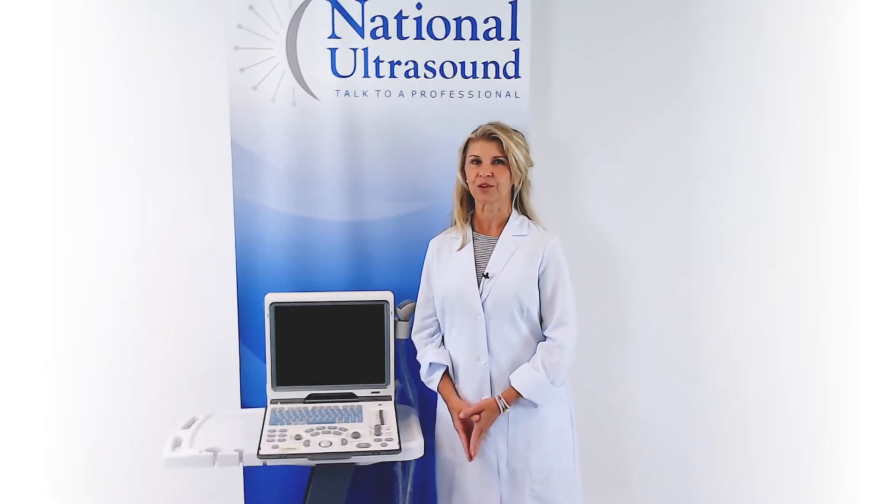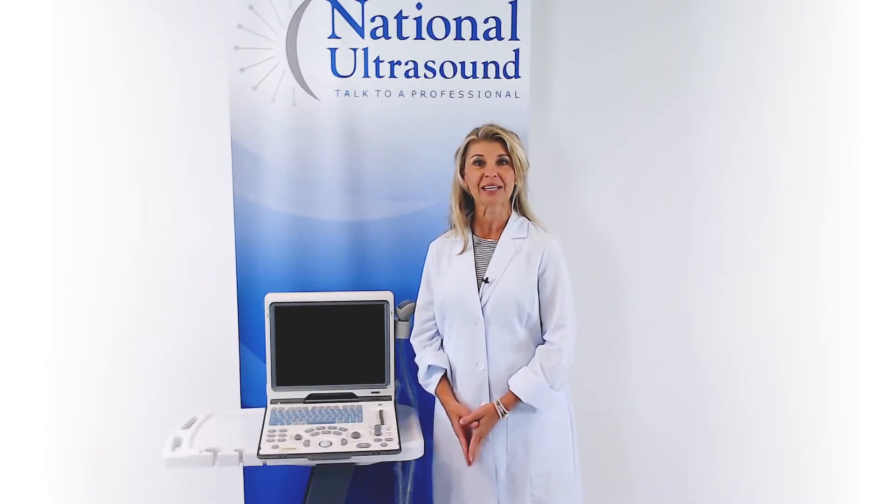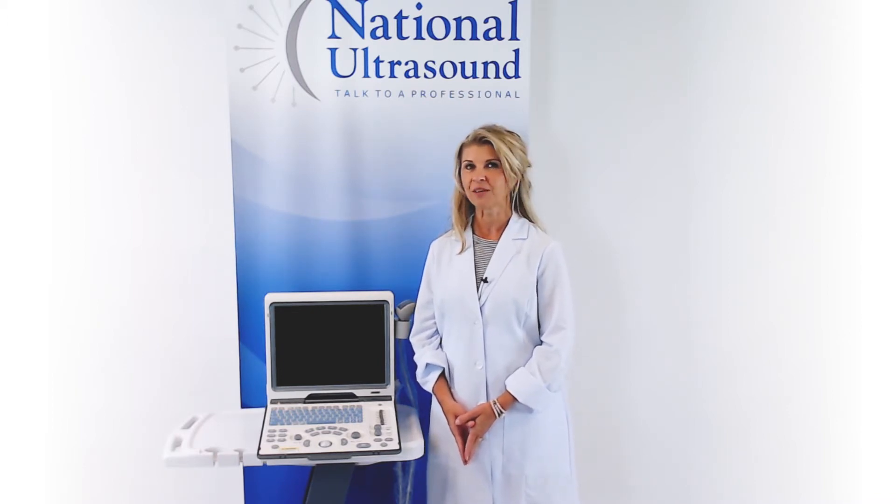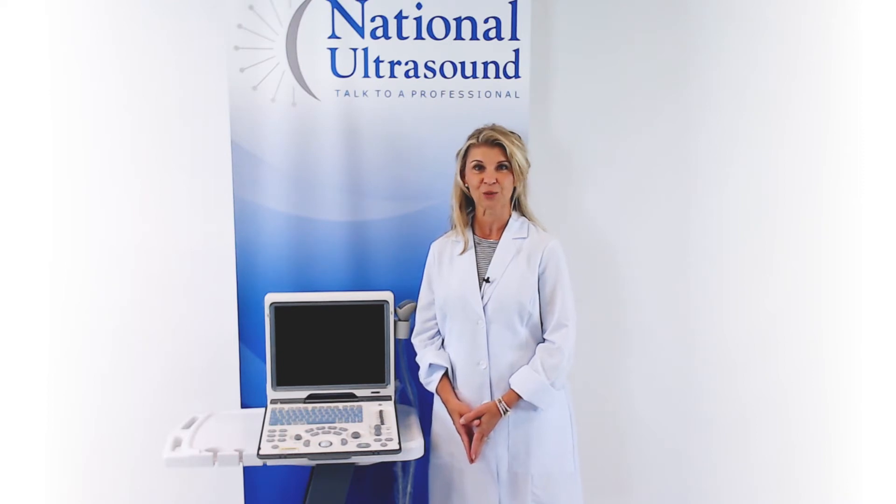Mindray's systems are known for their ease of use, including the easy and customizable reporting features. The DP50 also includes a 3-year manufacturer's warranty.